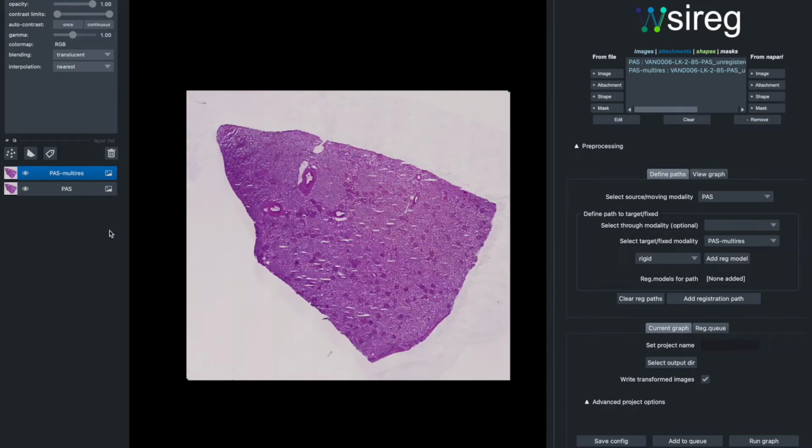And this is going to read in the full multi-res data. When we do that, we'll see, despite this image being much larger, the other image is just a few hundred pixels wide, whereas this one is at least 20,000 pixels wide, they do display already on top of one another. That's because underneath we use the pixel spacing to set the scale of the modality within the Napari viewer, so that when you load in multiple pieces of data with different scales, they will be scaled correctly within the viewer, and you can get a sense of the relation between two pieces of data.